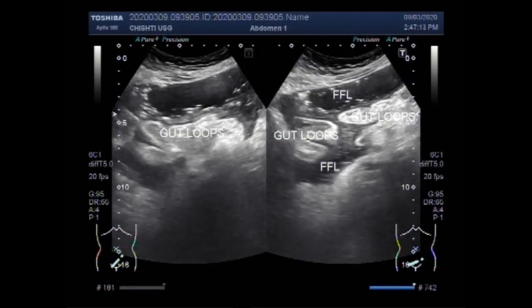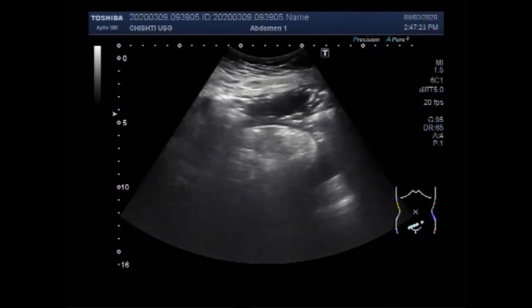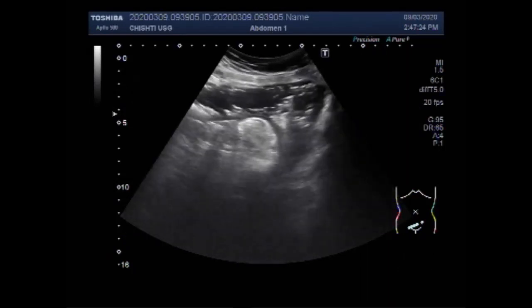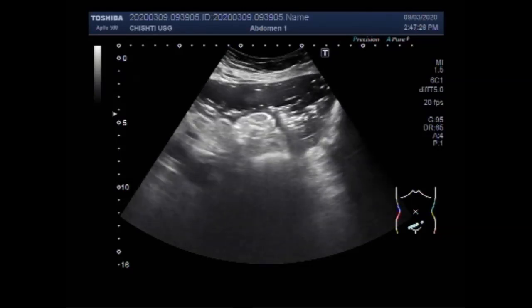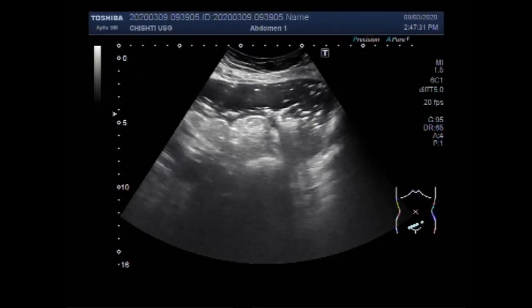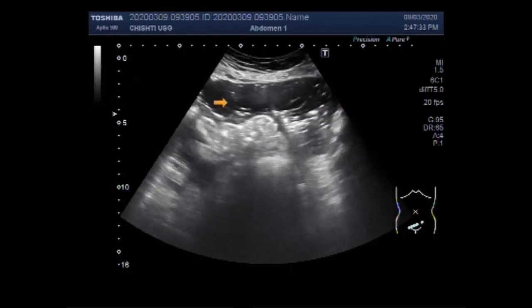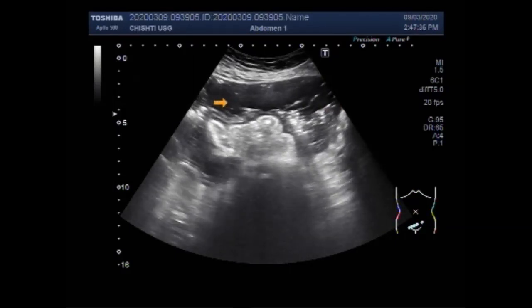Dear viewers, I hope you are all fine. This ultrasound video shows intestinal obstruction with sealed perforation. You can see the gut loops. The examination is conducted with a convex probe.